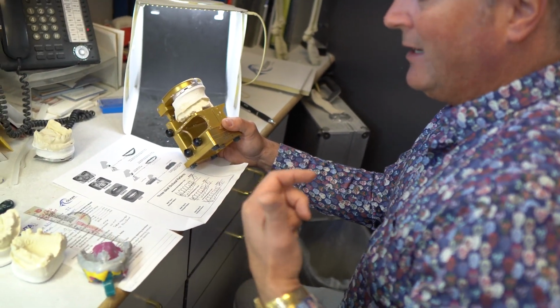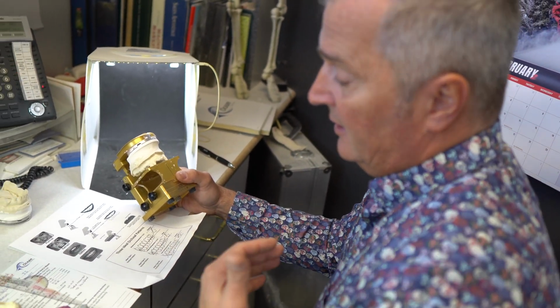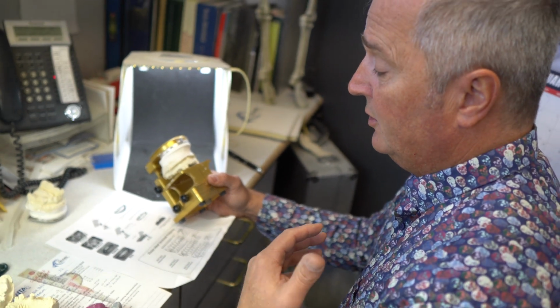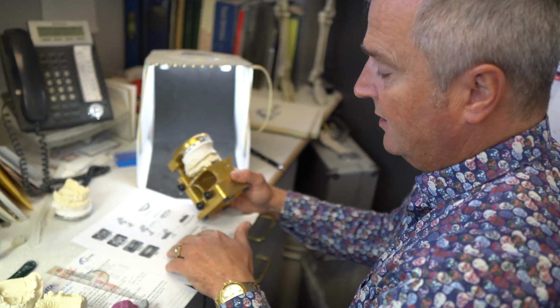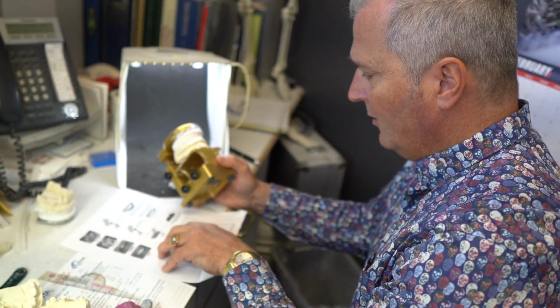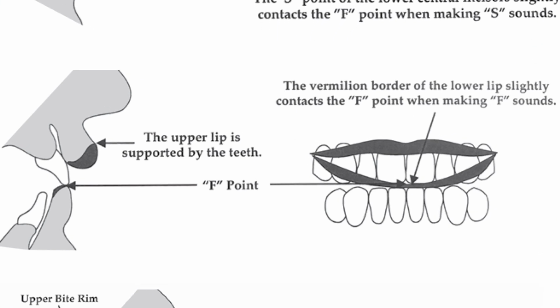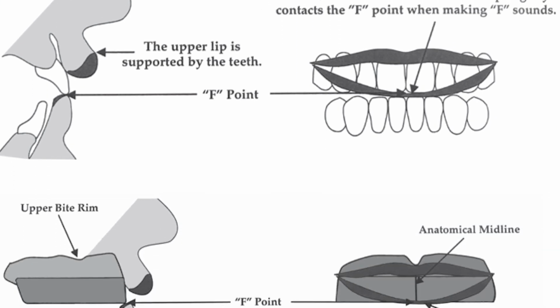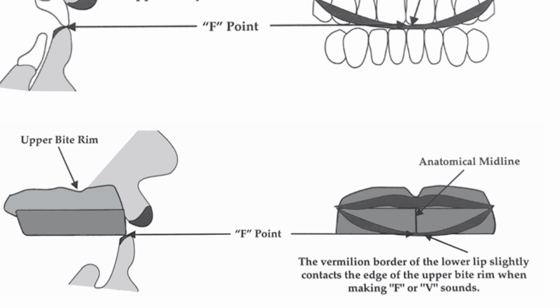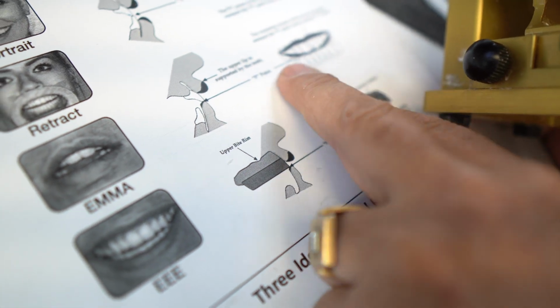But if you handle that right out of the beginning, then you know it's been dealt with. It's not a reactionary thing if it's not to the patient's expectations. So once we establish this F point, now we build a nice occlusal plane. This happens to be for a denture application, but ultimately we want an occlusal plane that basically complements this F point.